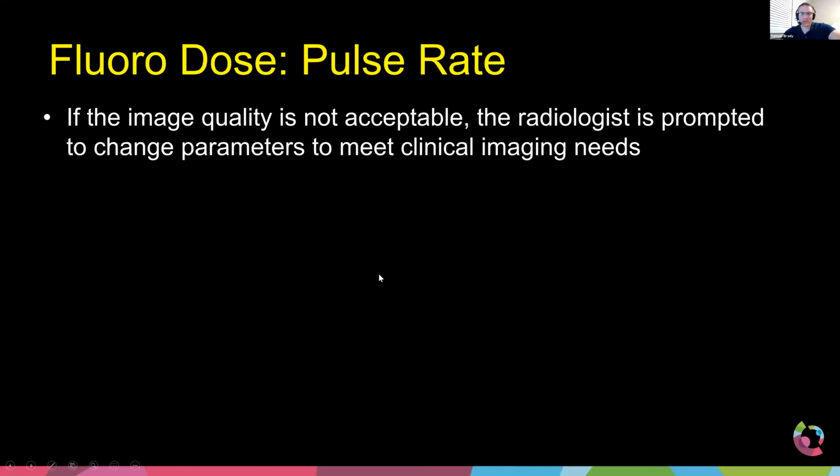The reality is, if you set the pulse rate low initially, and the radiologist or the operator walks in and starts working with the machine and thinks to themselves, I just can't quite see or do what I want, well, they obviously have the option to go up.